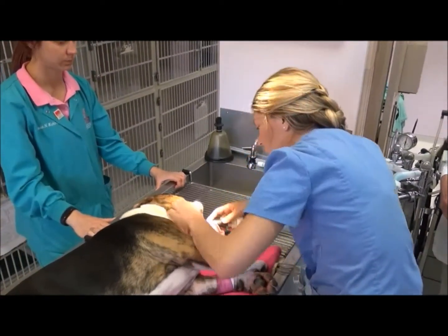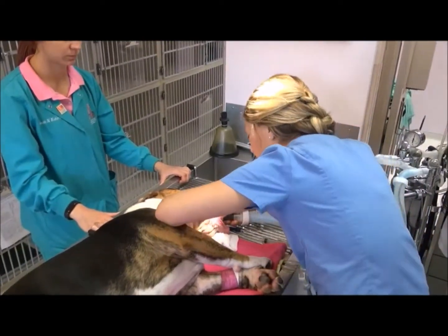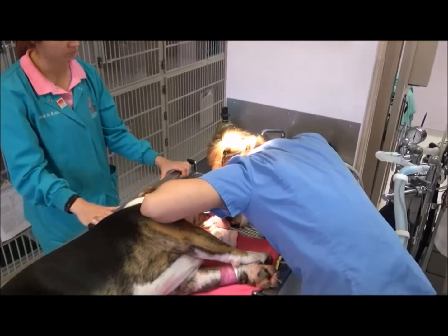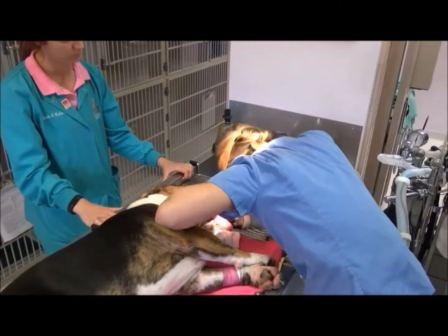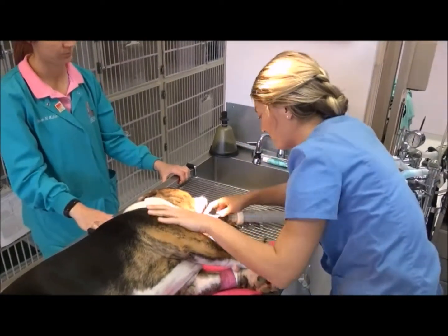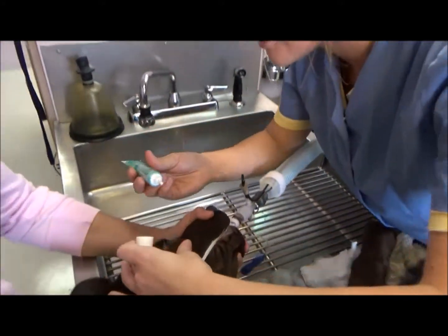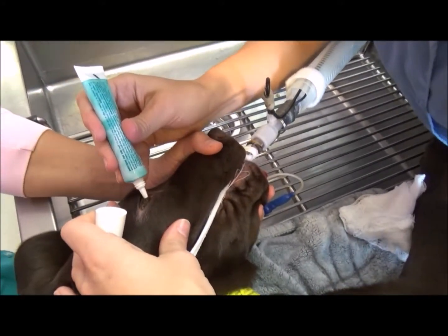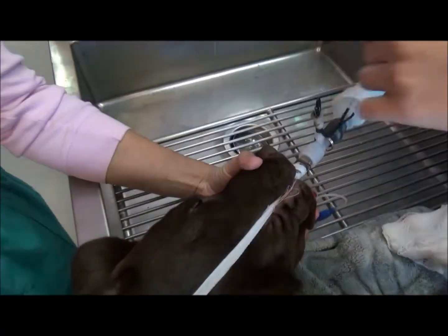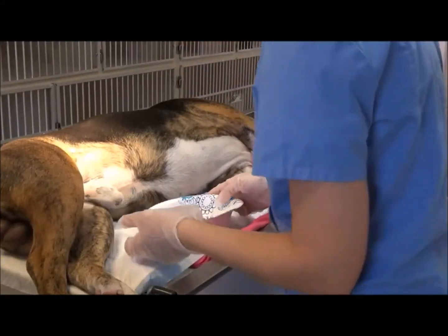But I also want to double check and make sure that I didn't insert the endotracheal tube too far. So I'm just going to listen here real quick and make sure I'm in the right spot. So I feel air coming out of the tube, so that means we're in the right spot. Thank you. Just gonna apply some artificial tears to both eyes here. That's good. Now I'm going to try to express the bladder if it's full enough.